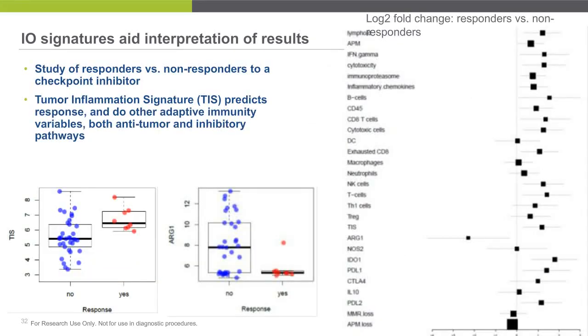Another use of the signatures is not statistical power, it's just simply understanding your data. There are a lot of genes, and many of us know what many of them do, but it's still pretty confusing looking at differential expression results for hundreds of genes, maybe half of which you've heard of if you've been working in the field a while.